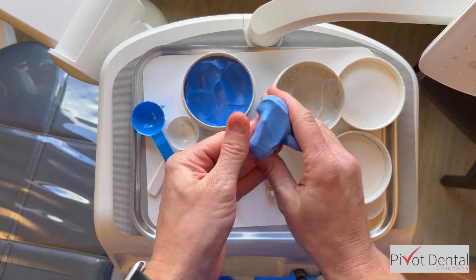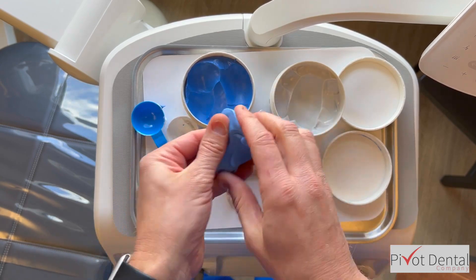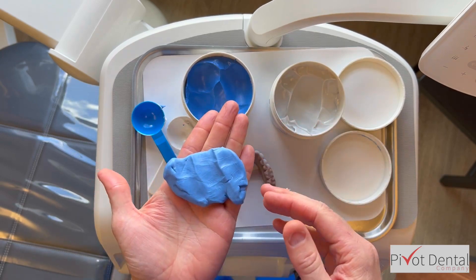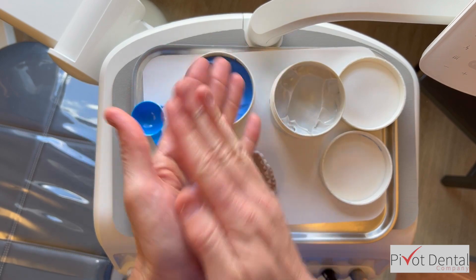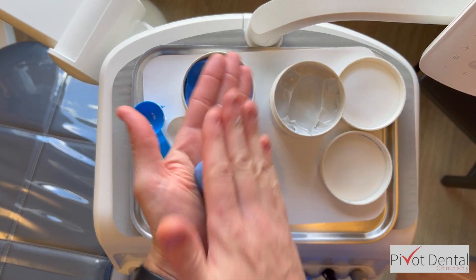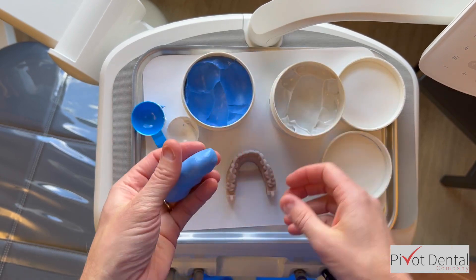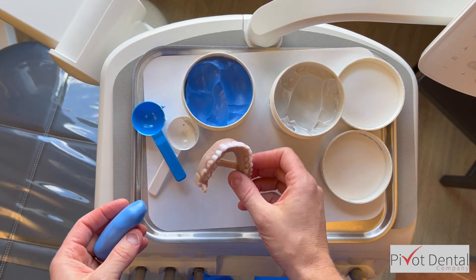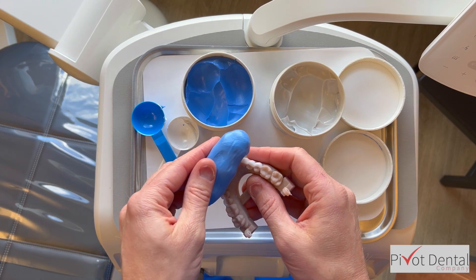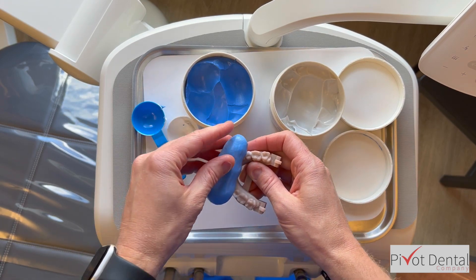On the bracket table is the wax-up that we're going to be taking a mold of. We took a 3D iTero scan of the patient's mouth and sent it to the lab, and they put wax on the teeth. The wax attached to these resin models isn't really that tight, so you have to be careful with it. Here's the wax-up — I roll it into a ball and flatten it out.